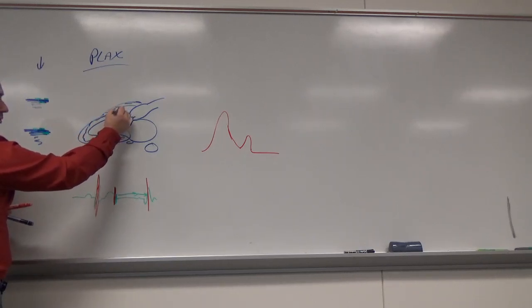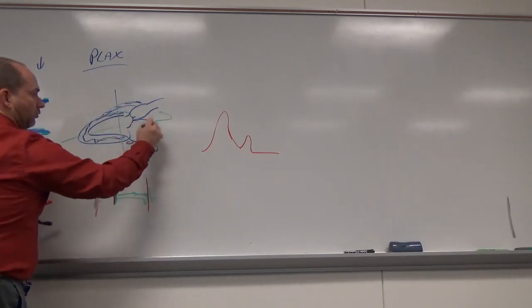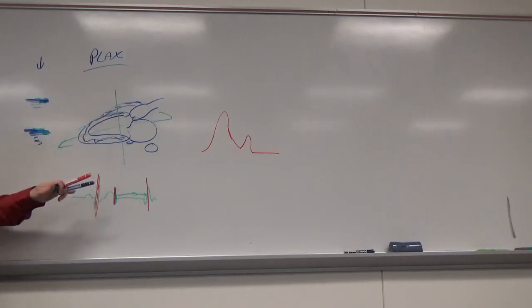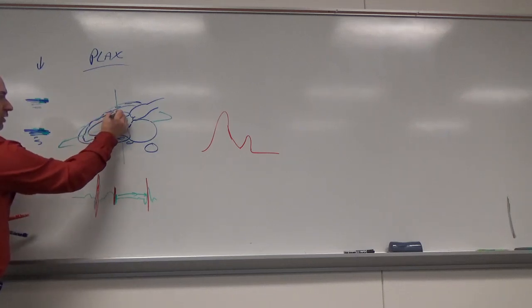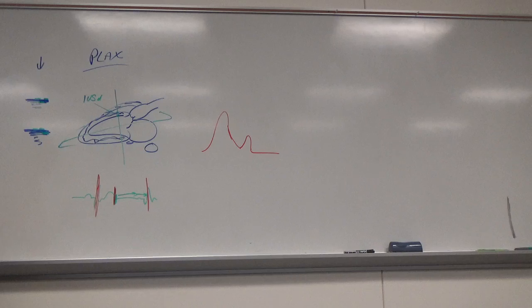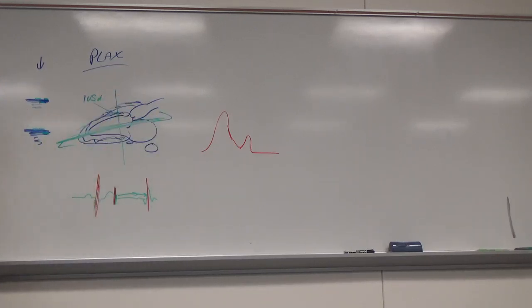Okay. So in diastole, right on the QRS, we're going to measure. You can measure the RV if you want. We should be at a perpendicular plane to the direction of the ventricle. So we need to be 90 degrees to that. We should not be at an angle, because then it's not accurate. And then you're going to measure the leading edge to the leading edge on this wall. So that's the septal wall, that's IVS. I'm going to write a small d, which signifies diastole. So the direction of the LV is this way. It should be 90 degrees to that, near the base.